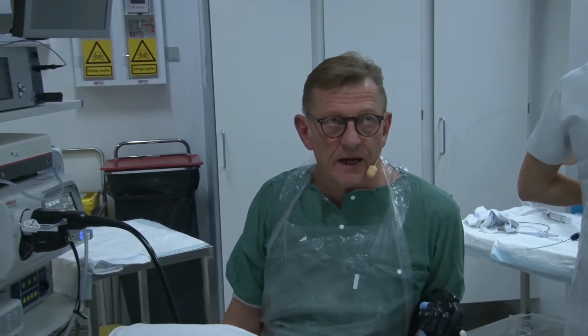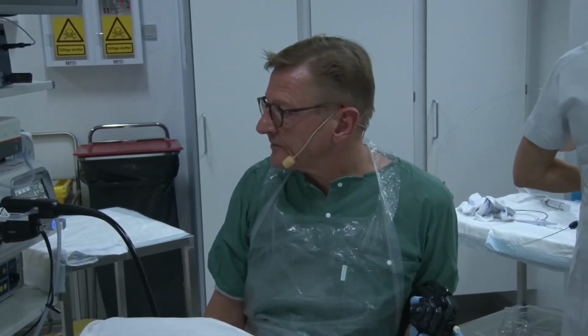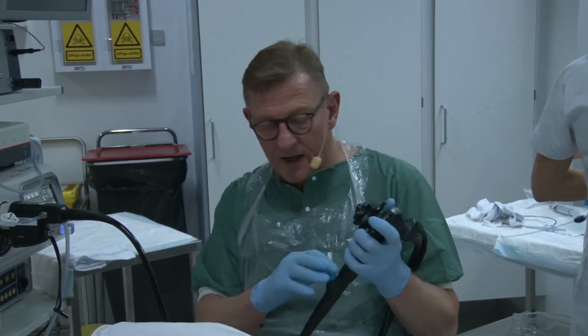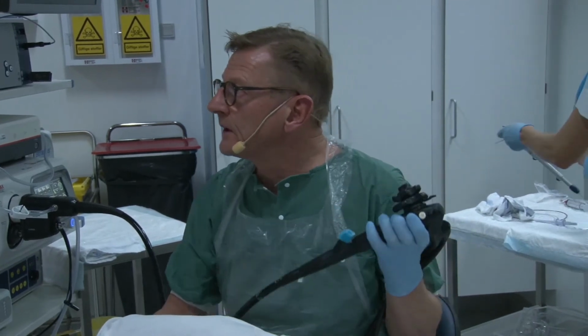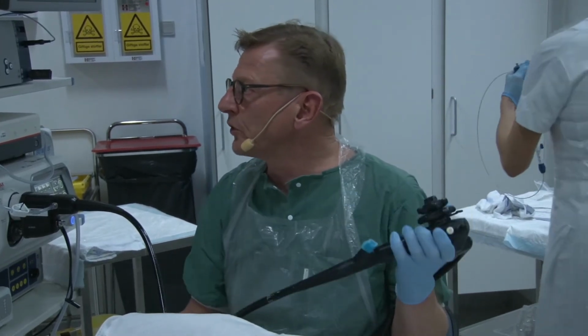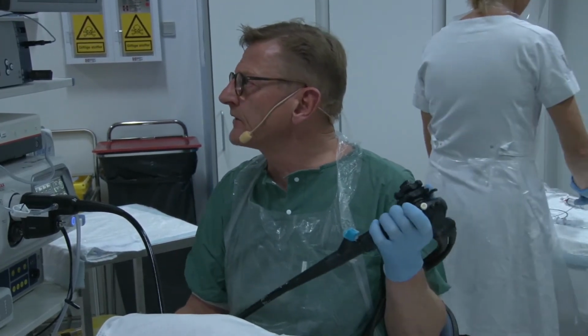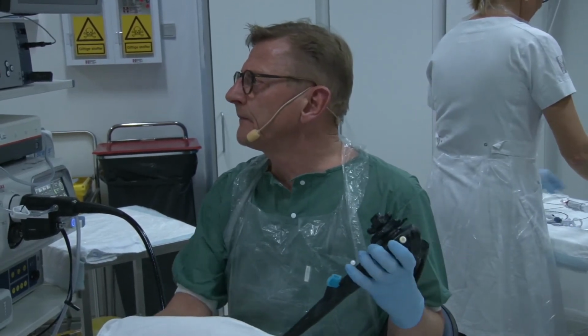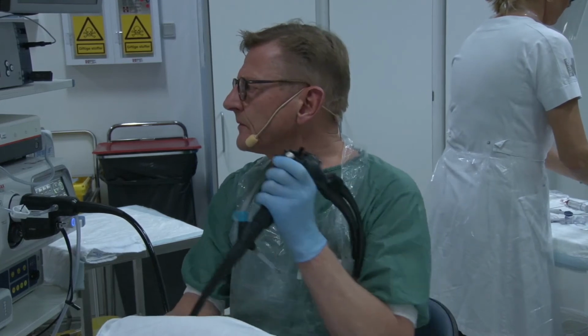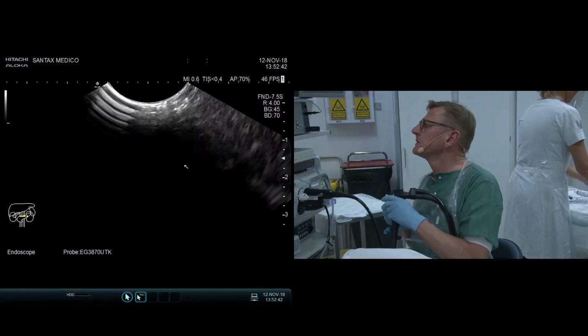Thanks. Yeah, and in the meanwhile, I think I will go to the duodenum, Lena, just to show some of the anatomy, as long as they're not ready in the other room. We have one more question, just a little bit. Yes. Can you say that?